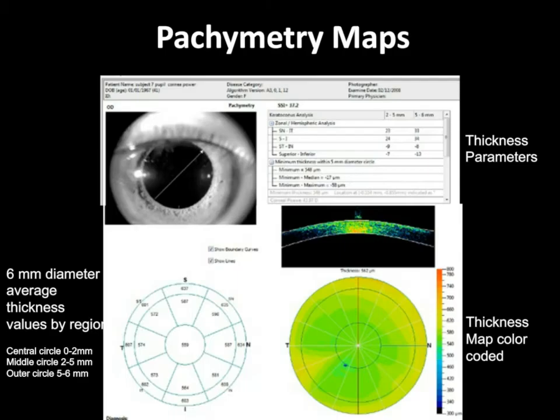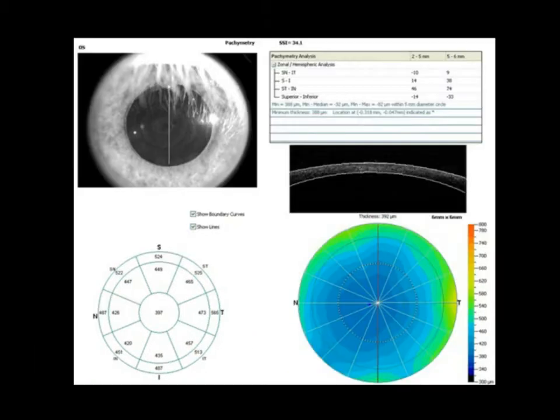So the ninth reason, and the ninth thing that's actually kind of changed the way we manage these individuals, is the anterior segment conditions that we're managing and monitoring. And there's a lot here, but I'm actually going to show you the most common reasons that we're actually looking at these patients.